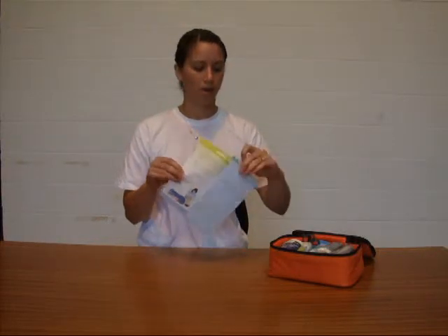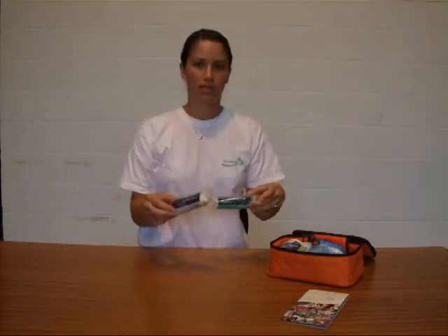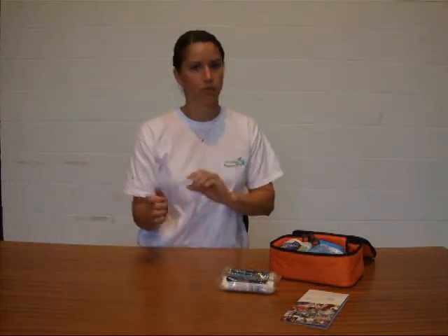On the top is our basic advice card — it's a great little aide memoir with your D-R-A-B-C aide memoir in there, just to use in any emergency situation. We've got a couple of medium dressings — that's the dressing pad with a bit of bandage attached so you can wrap it round and get somebody straight back onto the pitch.